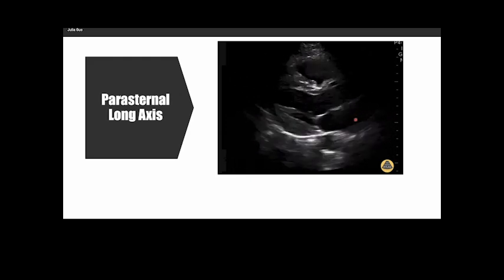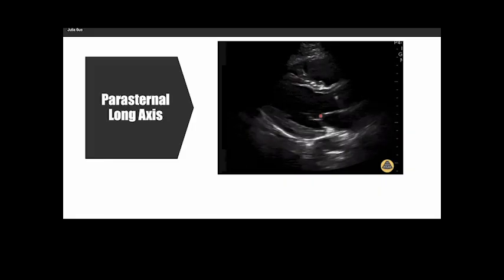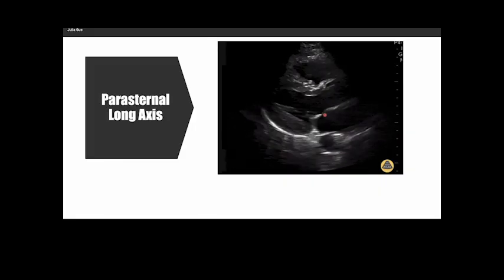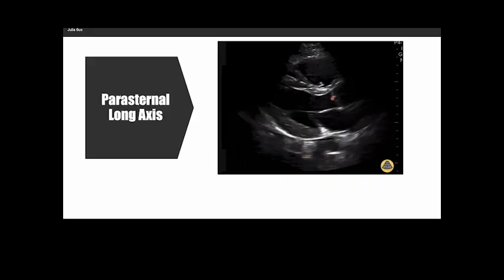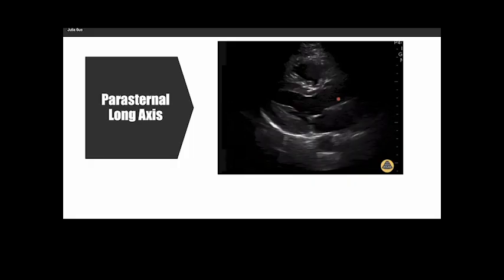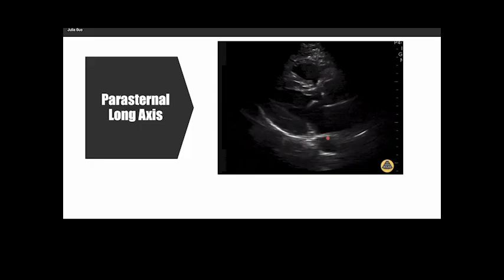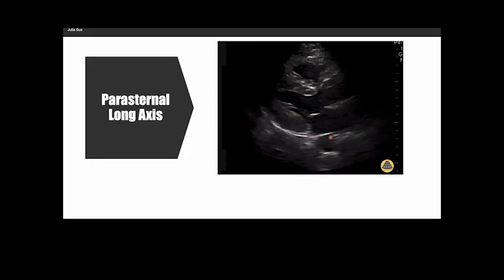This is the left atrium, and the valve in between that's flopping right here is the mitral valve. And then this is this valve right here, that's the aortic valve. And then this is the aortic outflow tract, okay? And here, this circle right here, this is the thoracic descending aorta.